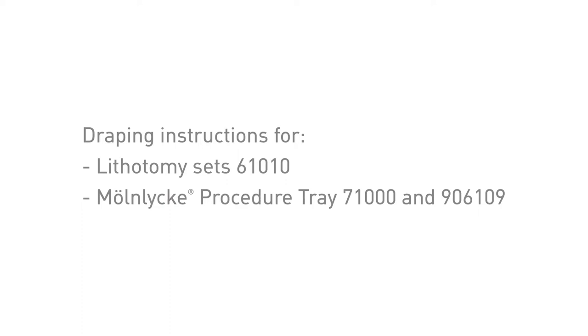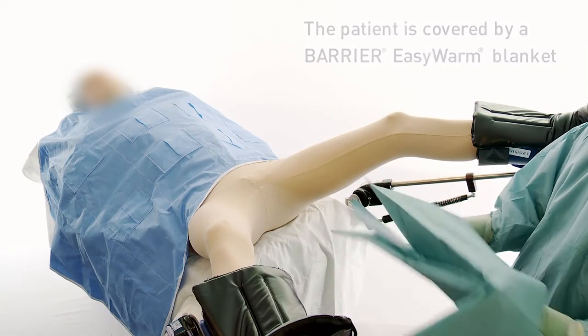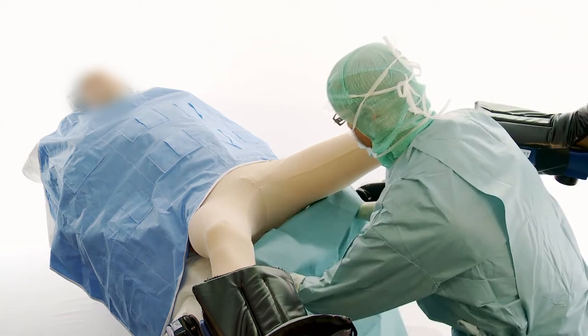Draping instruction for the Barrier Lithotomy Set from Mölnlycke Healthcare. To start draping, put your hands inside the folding and open the under buttock drape fully. Place it under the patient.